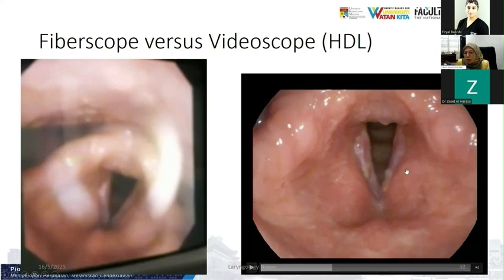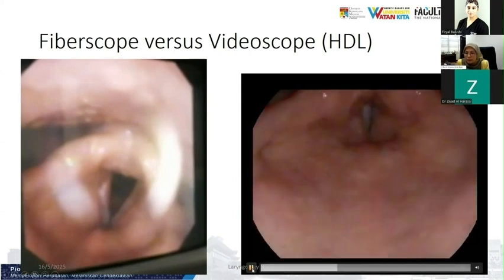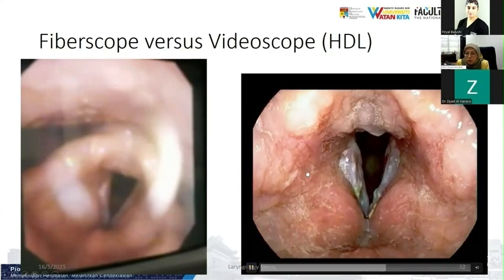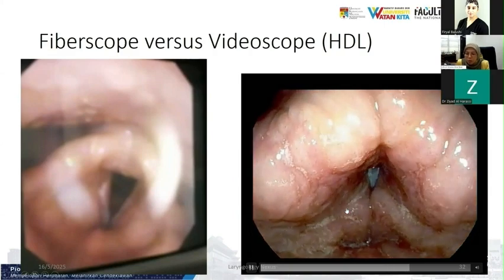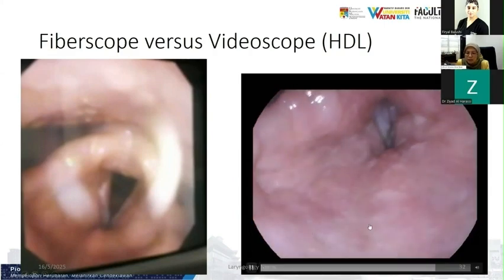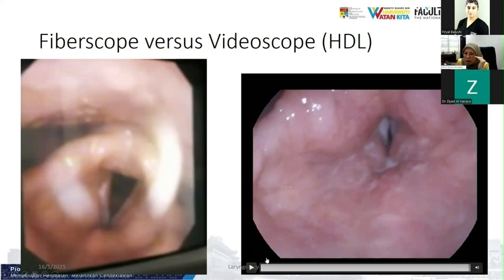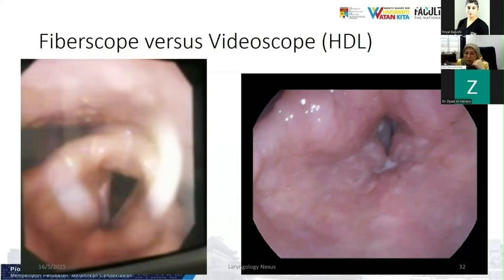So with white light video endoscope only, you can clearly see there are actually lesions bilaterally. And this is on enhanced laryngeal imaging, which I'm going to talk more about. Remember the SRI, there is asymmetrical mucosal wave, reduced amplitude bilaterally, but you can't really examine the whole vocal fold for any non-vibratory segment because there is severe muscle tension dysphonia.